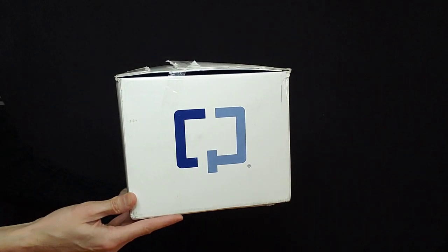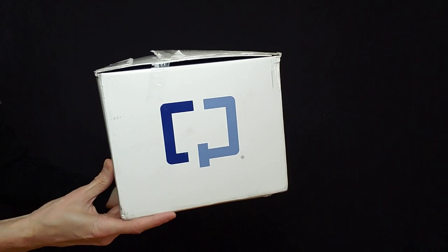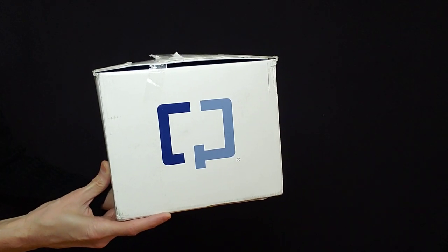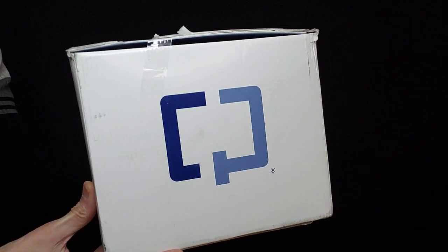Hello and welcome to my video. In this video, I will be unboxing the RX Prescription at Home ColoGuard Screening Test.